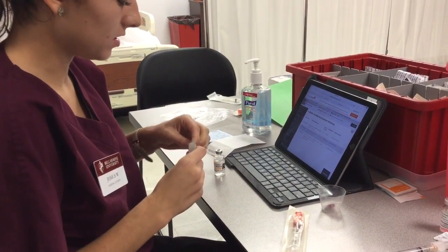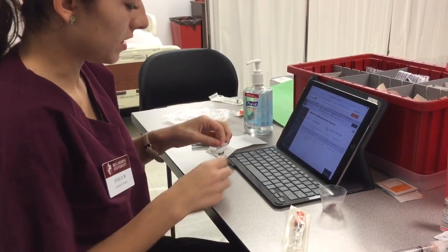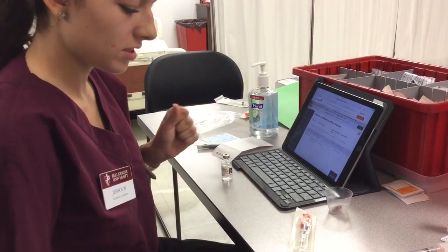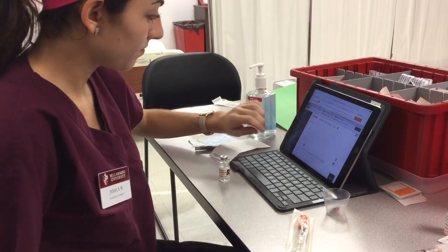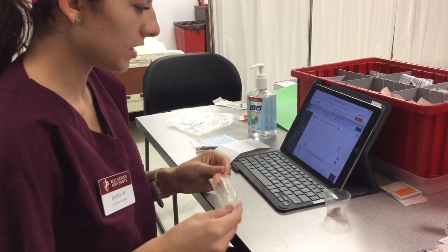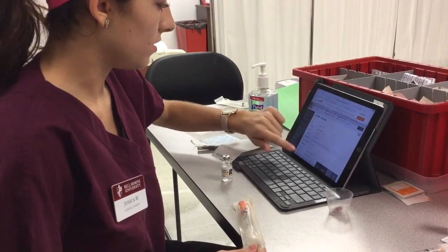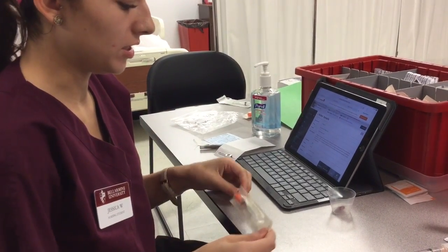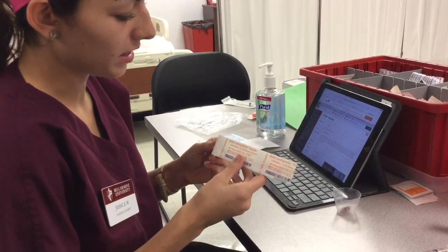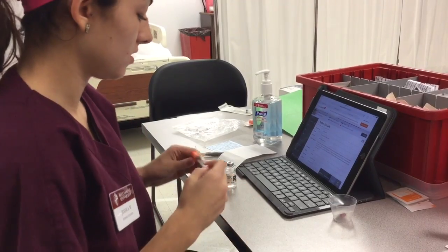And this is regular insulin, 100 units per milliliter. And we checked with the sliding scale, and the patient had a 263 glucose reading. And that was taken at 9:40 this morning and it was a 263. So according to the sliding scale, we're going to deliver 15 units. And this is an insulin-specific needle because it's a high-risk medication, so it's the universal needle for insulin.